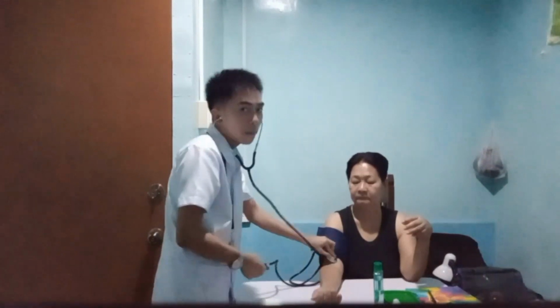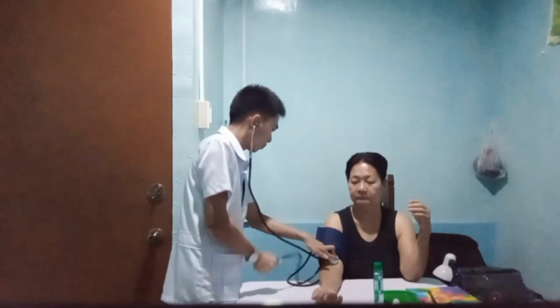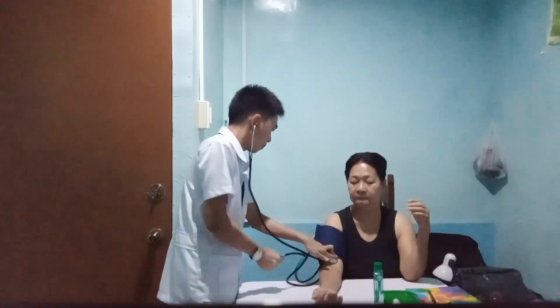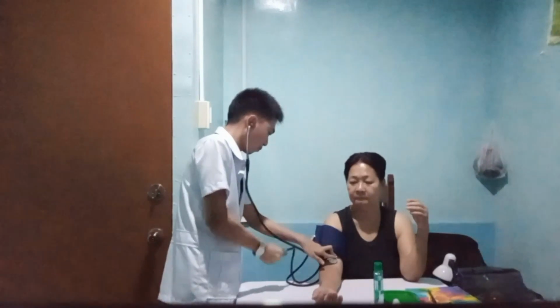Now let's auscultate the client's blood pressure. Pump the cuff until the sphygmomanometer reaches 30 mmHg above the point where the brachial pulse disappeared. Now release the cuff until the pressure decreases.